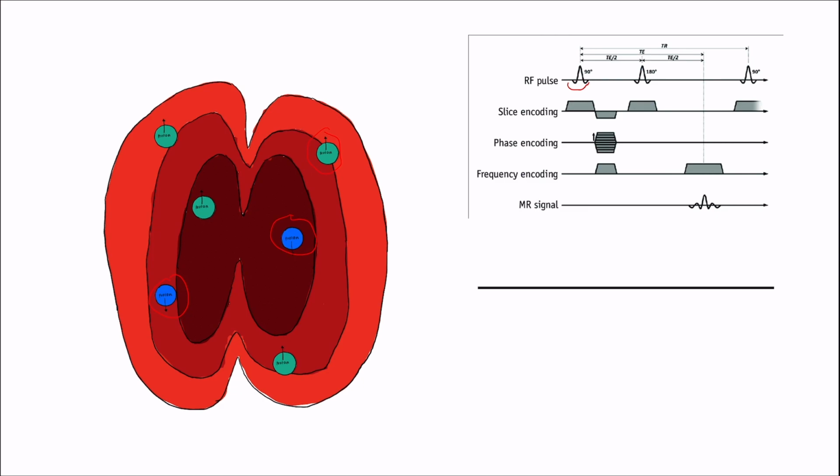Well, so therefore we do not have uniformity yet, but how do we create that? The RF pulse also creates a kind of MRI signal, but the signal is very opaque and we can't really read it because the uniformity is not achieved yet. Well, how do we do that? We also stimulate it with a 180 degree RF pulse, and this is kind of difficult to understand initially, because the 180 degree RF pulse allows for uniformity to occur, and therefore we get a clear signal, and the signal is also referred to as an echo, and this echo is then used to create a good quality image.